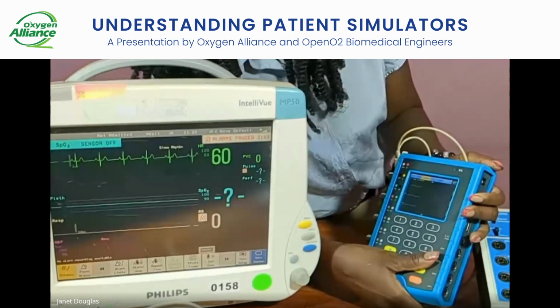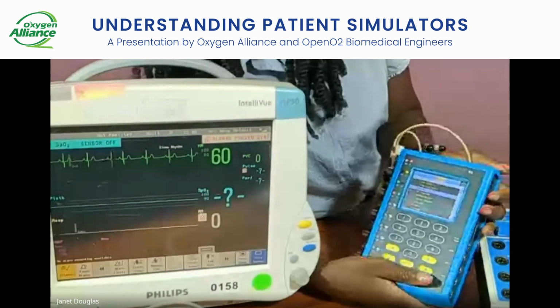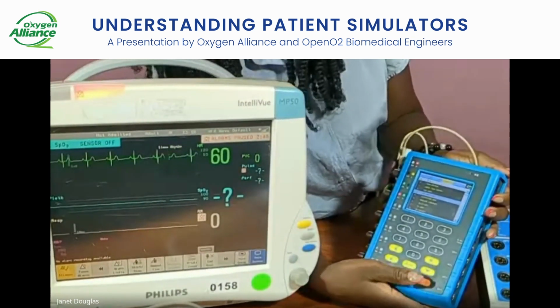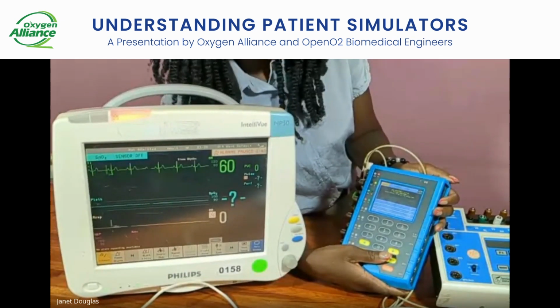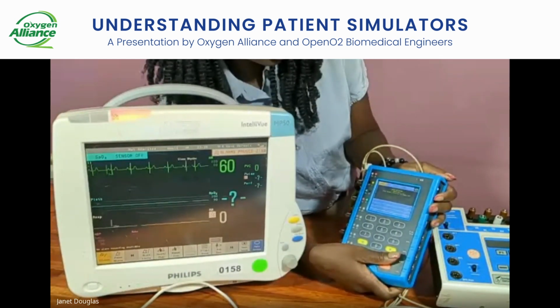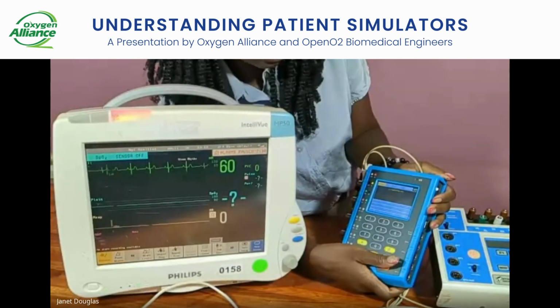I can also try to change, let's say, the amplitude. If I check, my amplitude is showing me 1 millivolts, but I can choose to increase or decrease it.